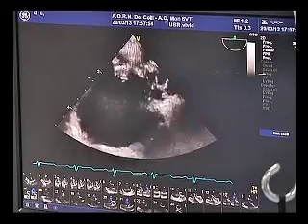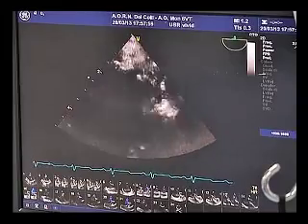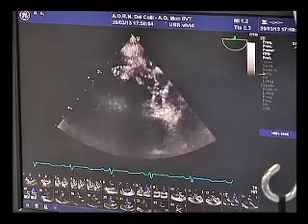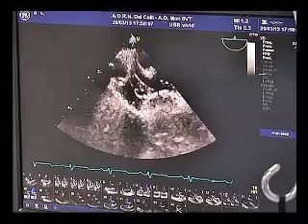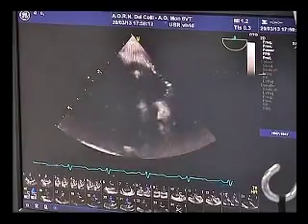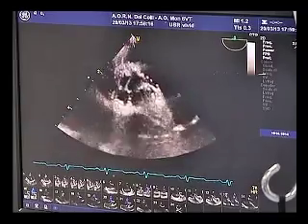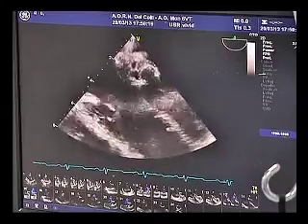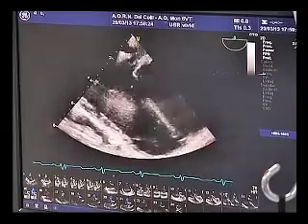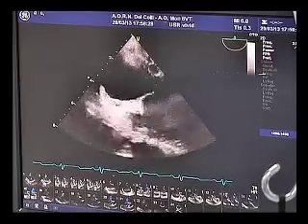Can we see it at 90 degrees? What's your opinion about it? I think that larger device, when you had the other device in place, was not allowed to expand properly, and that's why it looks so large. Once the other one came off, this device is now fully expanded correctly and is probably compressing onto the other hole. So I think one single device, it looks so far, I have not seen any clear shunt now. Do you agree about leaving just one device inside?